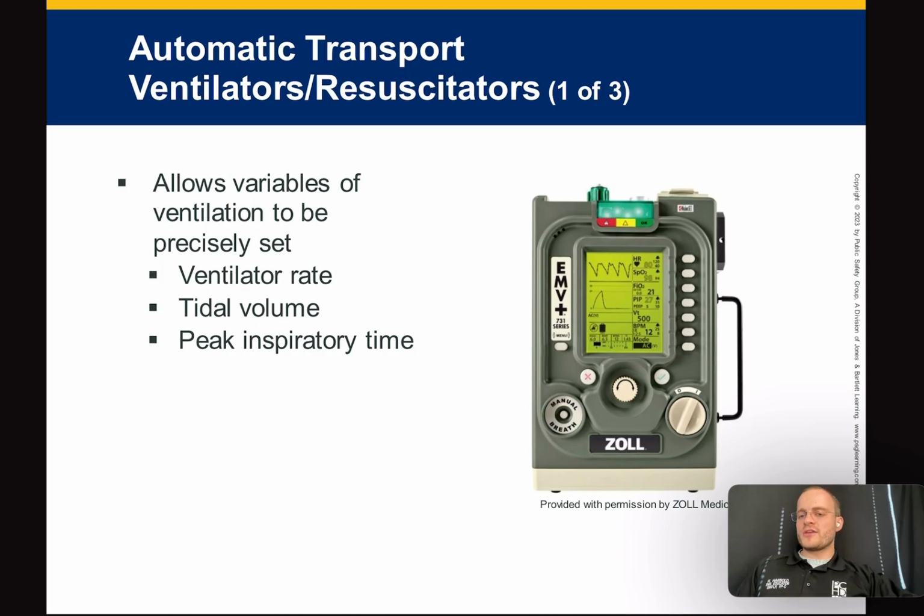These can do a lot, right? You can set the rate, the respiratory rate, also known as the frequency, F. The tidal volume, again, this is only around 500. The peak inspiratory time, so this can tell you how long you want to deliver that breath.